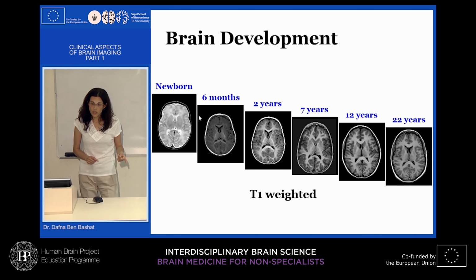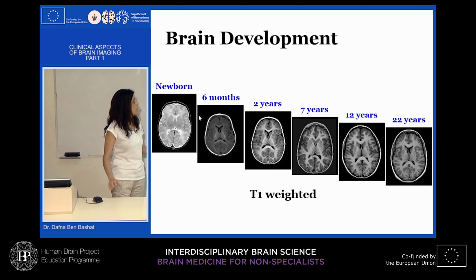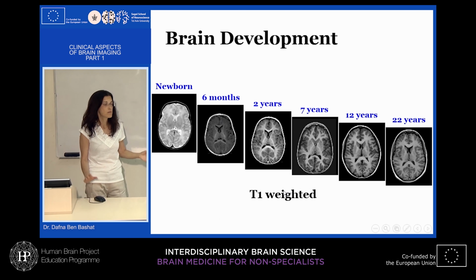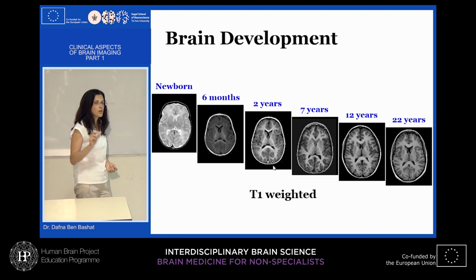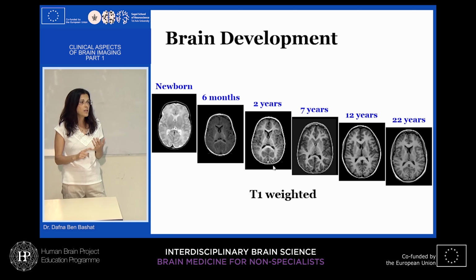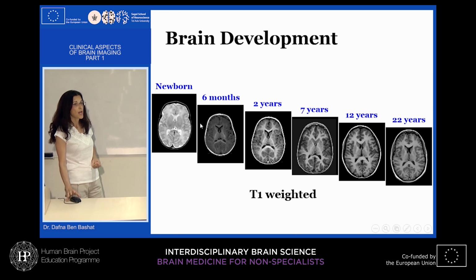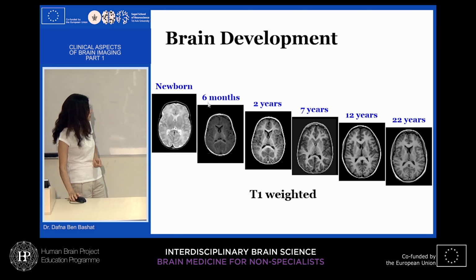Use and limitation. When we talk about brain development, we just take this one T1 contrast, which is very simple. But during brain development, especially during the first 2 years of life, there is a lot of myelination, synapse formation, and very dramatic changes within the brain. The water content of a newborn is very high relative to a 2-year-old child.